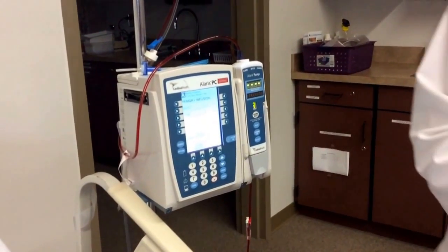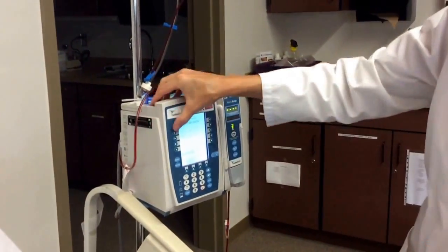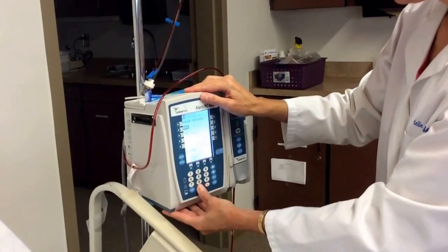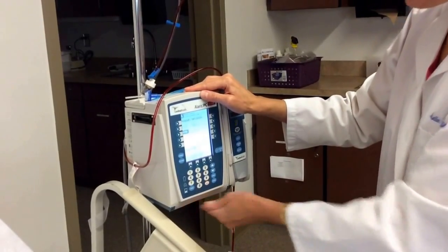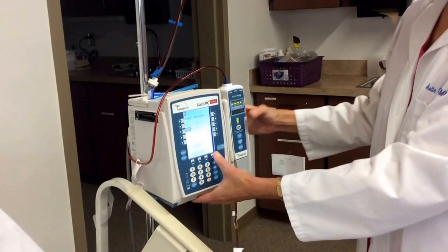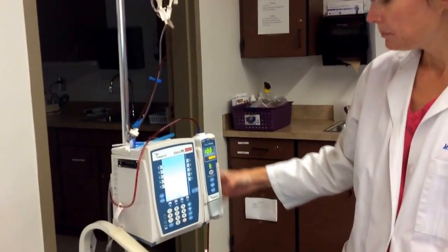I'm going to initiate this blood transfusion at 100 milliliters an hour. And I'm going to fix my volume at 25 milliliters. And then I'm opening my clamp and I'm going to start this blood transfusion.